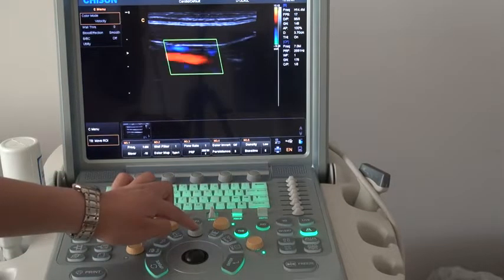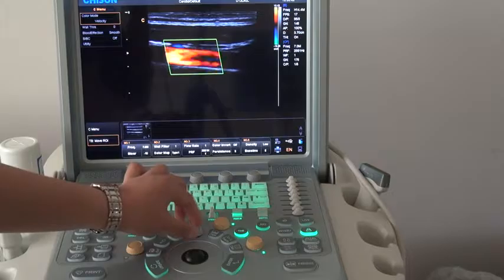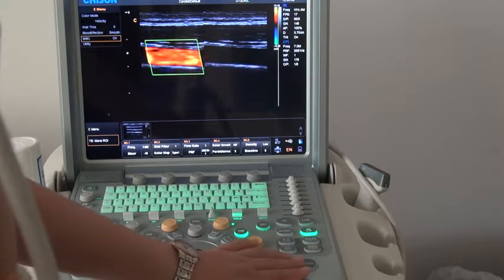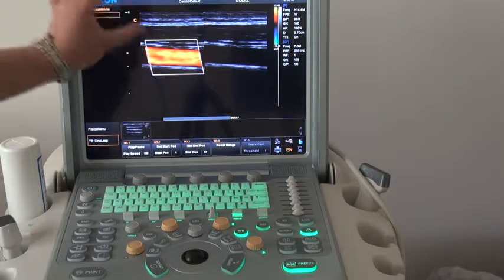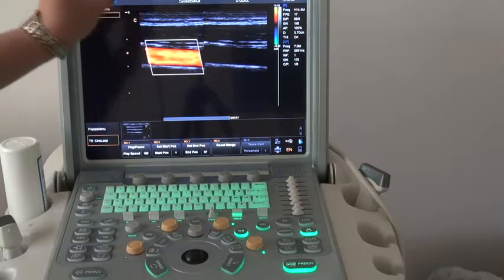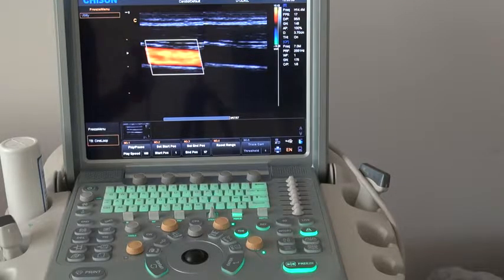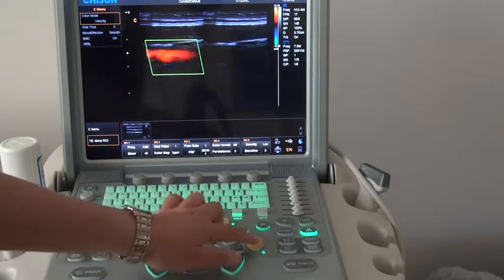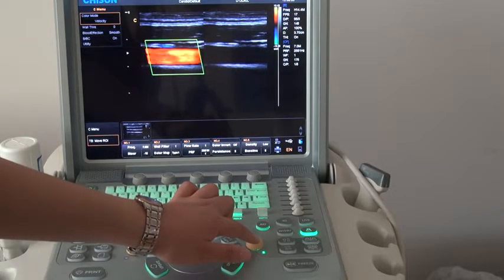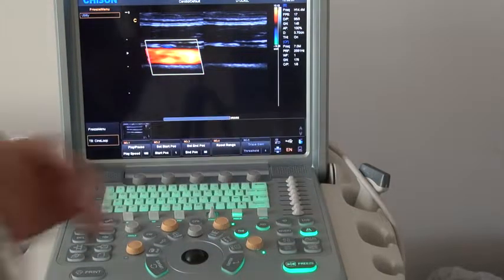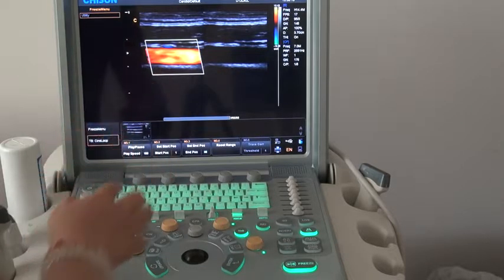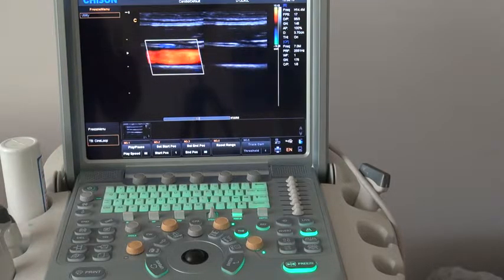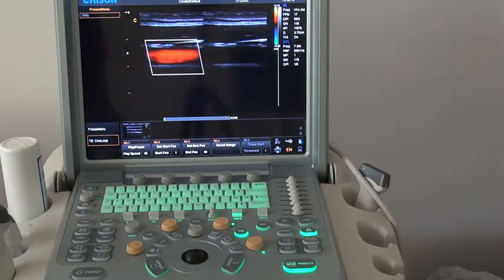After entering C mode, we can press the menu key to open the BBC mode. You will find one is the black-and-white image and another is the color image — the color image and the black-and-white image can be displayed on the screen at the same time. After that, you freeze the image. Also, you can replay the scene. Press play and pause — it will replay the scene you have just scanned.